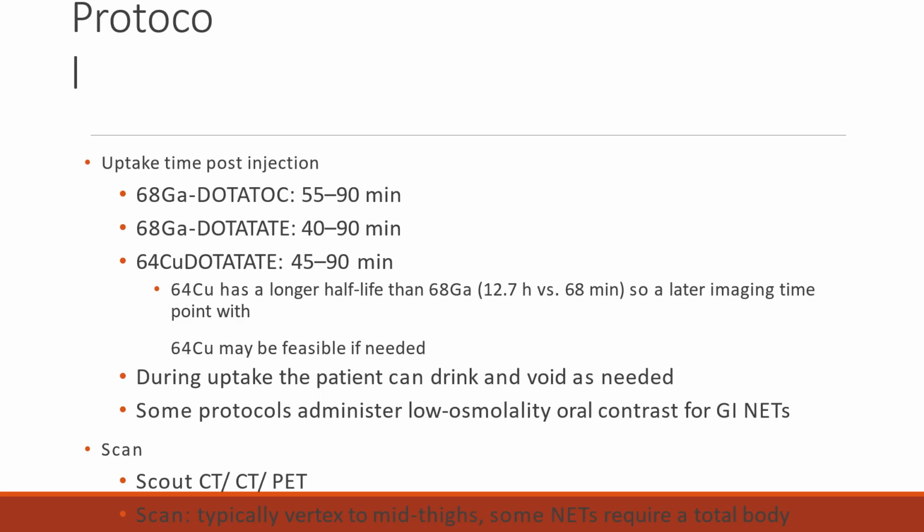All right, so protocol, I don't know why it's written like that. Let's just go with it. The uptake time post-injection is roughly about an hour for all of them. Now it says 55 to 90, 40 to 90, 45 to 90. Most of the time we just cut it right down the middle and say, okay, about 60 minutes, because then you're good no matter what.